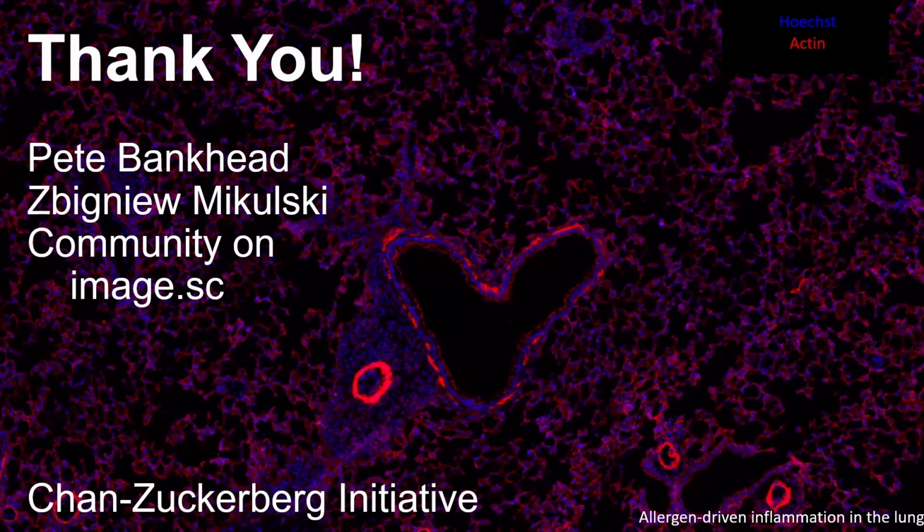All right, I want to say thank you first to Dr. Pete Bankhead for making the software in the first place, and to Zbigniew Mikulski, the director of the core here at the La Jolla Institute for Immunology, and also the community at image.sc for really teaching me quite a lot about image analysis in general and QuPath specifically. And I'd like to thank the Chan Zuckerberg Initiative for my funding.